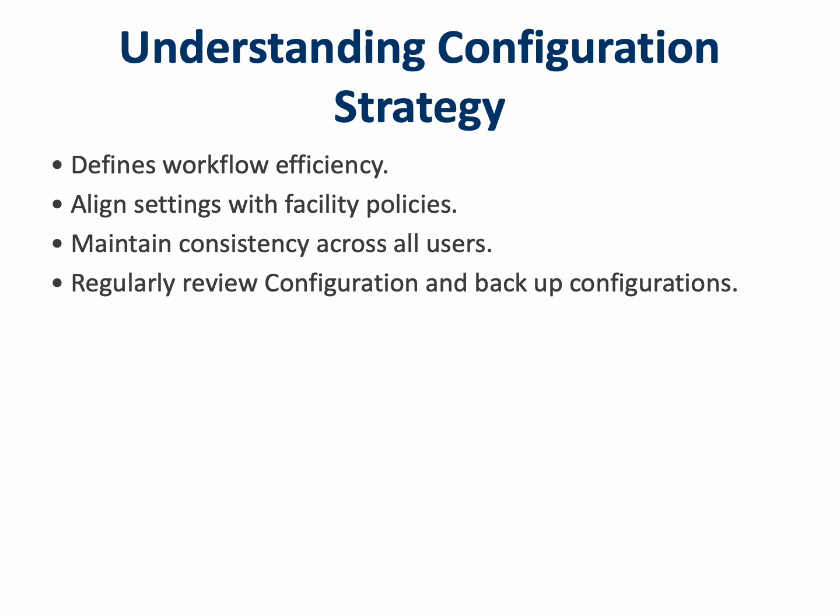Language, time, and date settings influence traceability. Asset ID formats impact record keeping. User profiles affect accountability. Your configuration should align with your hospital or service provider's standard operating procedures. Consistency across devices ensures that every technician sees the same menus and reporting structures. Once configurations are finalized, back them up using MedDeviceEngineerX or external memory. This prevents data mismatches and keeps your testing environment standardized and audit ready.